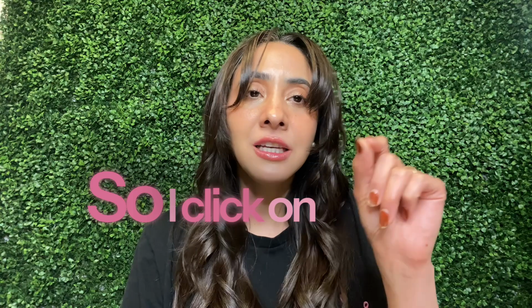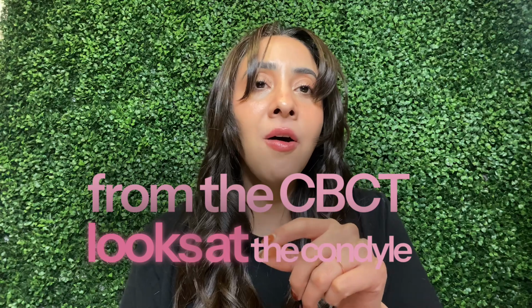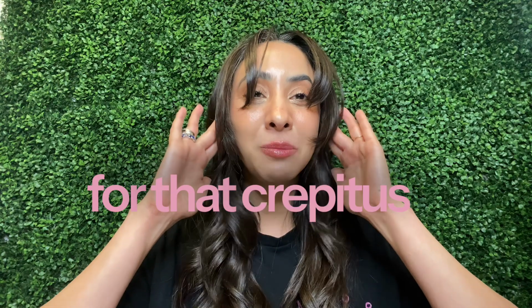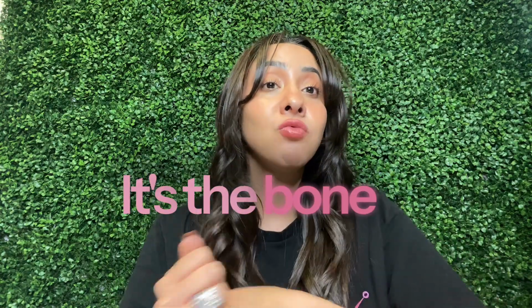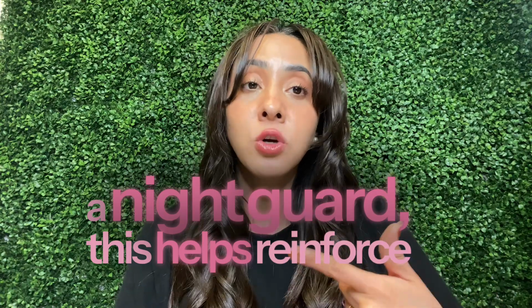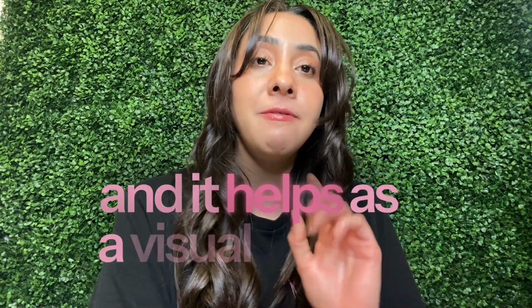After the PANO, I am looking at the TMJ. So I click on each condyle, and then again, the artificial intelligence from the CBCT looks at the condyle. As a part of our head and neck exam, when we have the patient open and close and we're feeling for that crepitus or popping or locking, I can show the patient, this is what your bone looks like. When you hear that popping, it's the bone rubbing against the bone. And so that visual is really important. Also, if the general dentist has recommended a night guard, this helps reinforce why we need a night guard, and showing them abfraction lesions, tori, that kind of stuff. So it helps my consultation, and it helps as a visual for the patient.